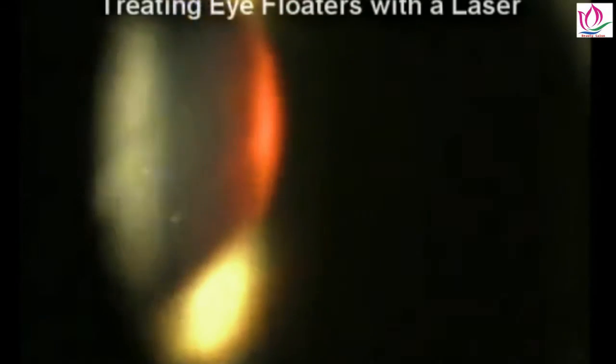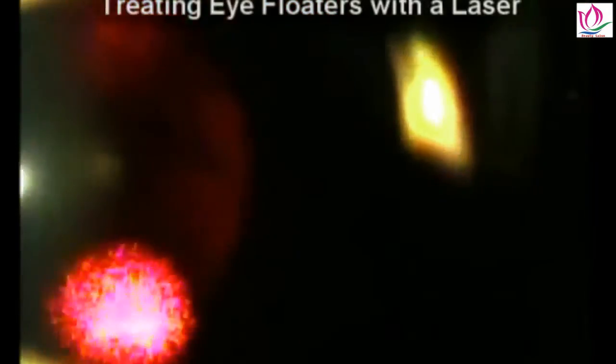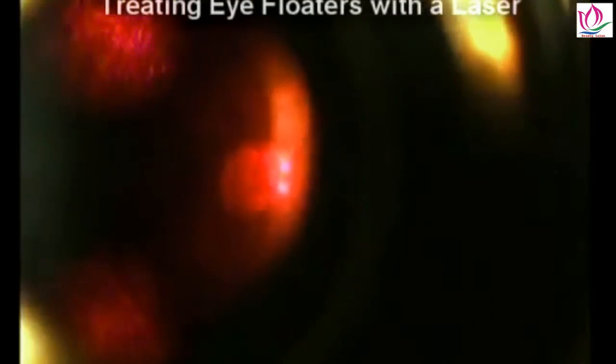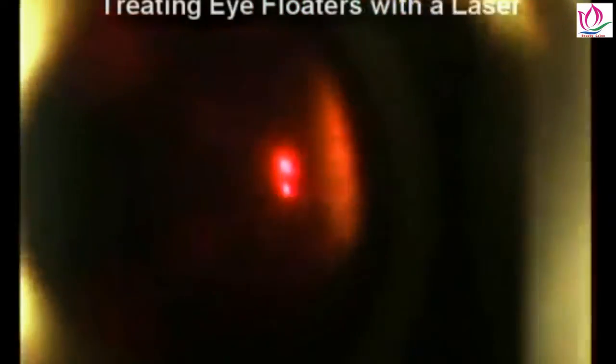The Weiss ring floaters are my absolute favorite because you get nearly immediate gratification. The patient gets nearly immediate gratification, and they require the least amount of treatment. You sometimes have to go back and do a little tidying up, a little cleanup, a little touch-up procedure to get some of the fragments that were moved out of the way. But this is an opportunity to cure that floater.